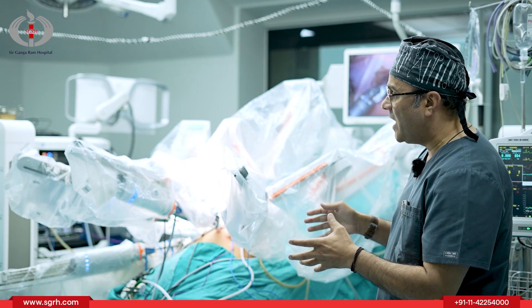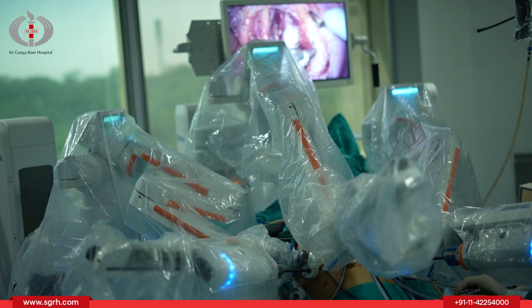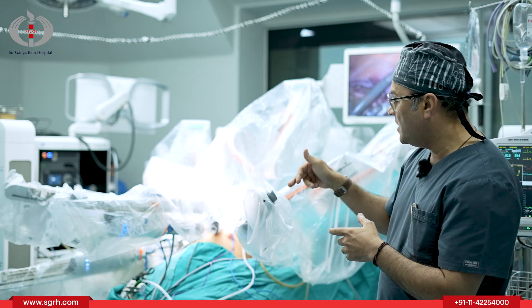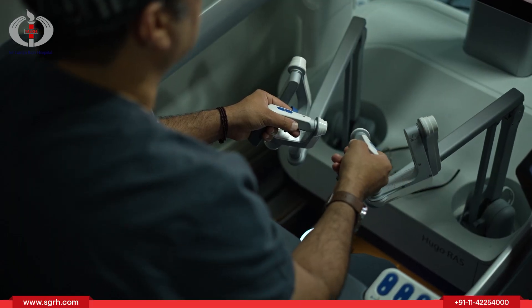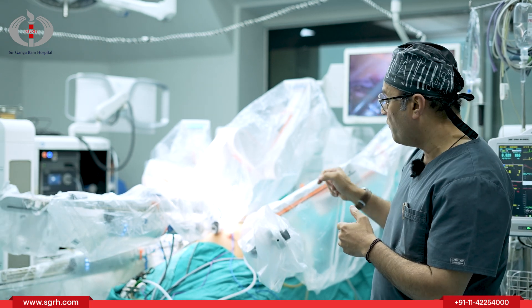These arms have two parts. One of the arms, which is the center one, is the camera arm through which the camera goes inside and we have a vision of whatever is happening inside the patient's body. These are the working arms, and the surgeon making movements at the robotic console has those movements transmitted to these arms in a real-time manner — whatever movement is made there is followed here.